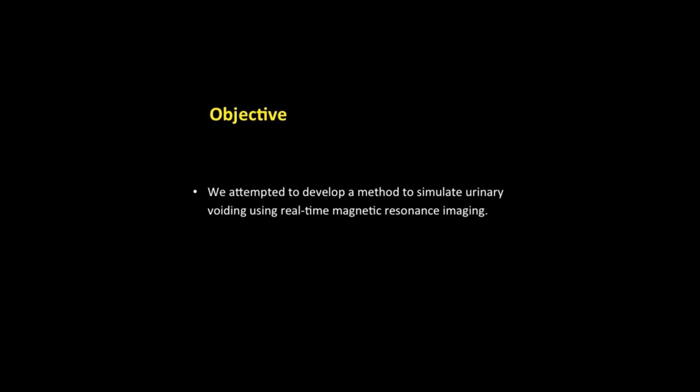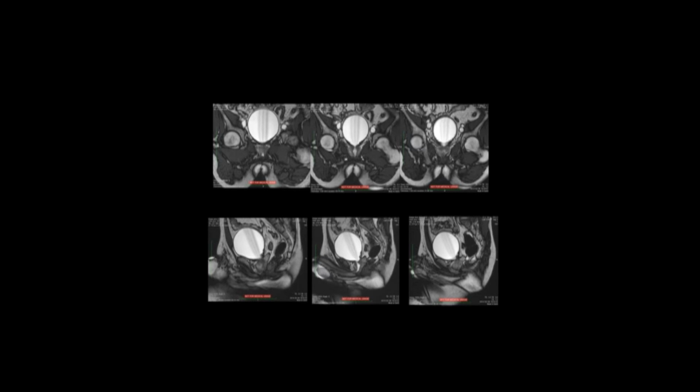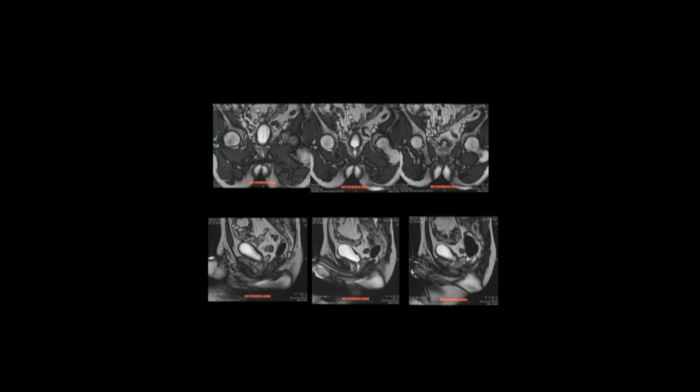To investigate the mechanism responsible for urinary spiraling during micturition, we developed a non-invasive MRI protocol that computes fluid dynamics and simulates male voiding. Uroflowgraphic assessment was done during urinary voiding in the lateral position. To visualize the entire pelvis and urethra, a sagittal plane image was obtained such that a line connecting the coccyx and pubic symphysis could be observed.